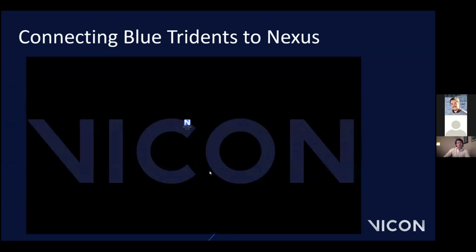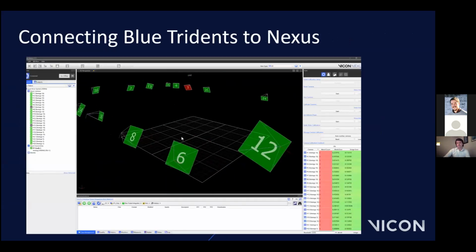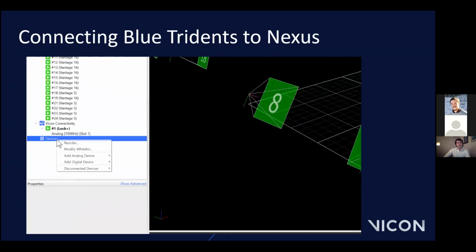So I have a screen recording here, just taking us through that process of connecting the sensors. So firstly, you open up Nexus and allow all your cameras to connect as usual. And once everything in the system tree is green, you can go to your devices node where you can right click and select modify whitelist.